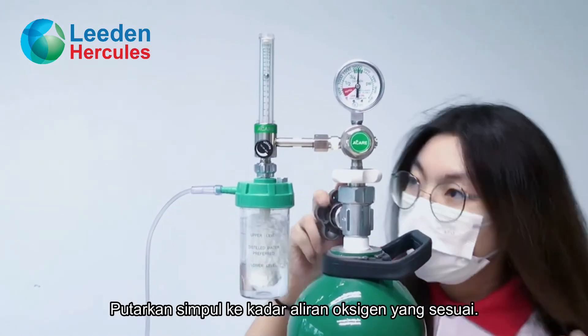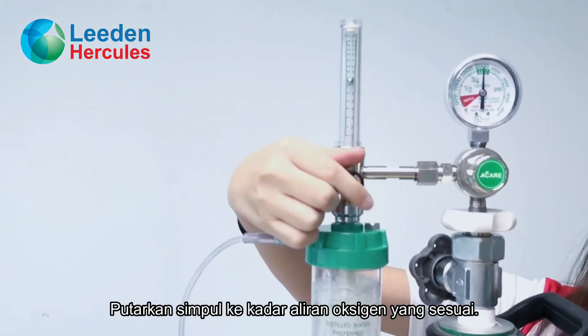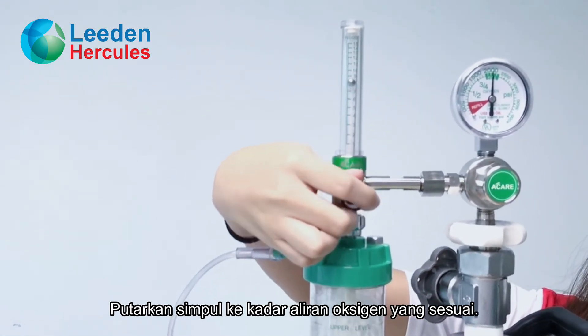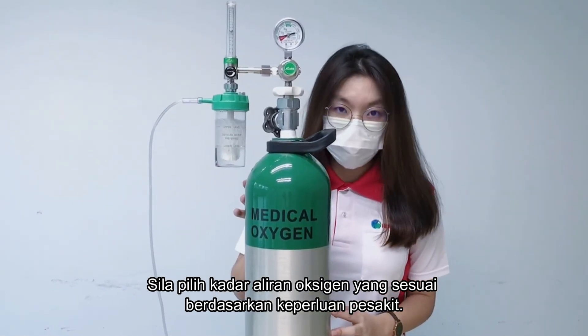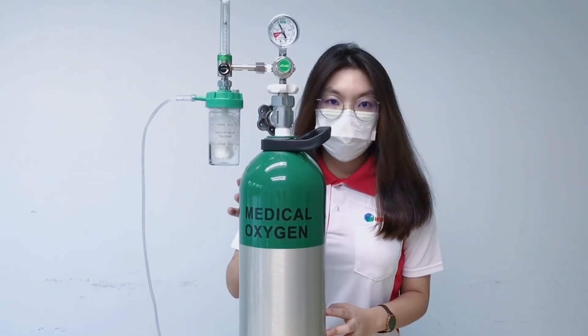Then, turn the knob to the suitable rate of oxygen flow. Please choose the suitable rate of oxygen flow based on the patient's needs. That's all for the installation. Thank you.